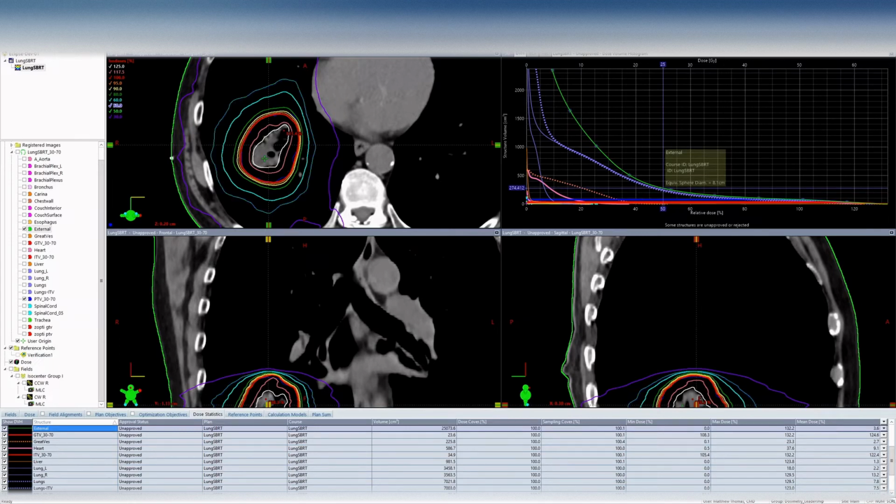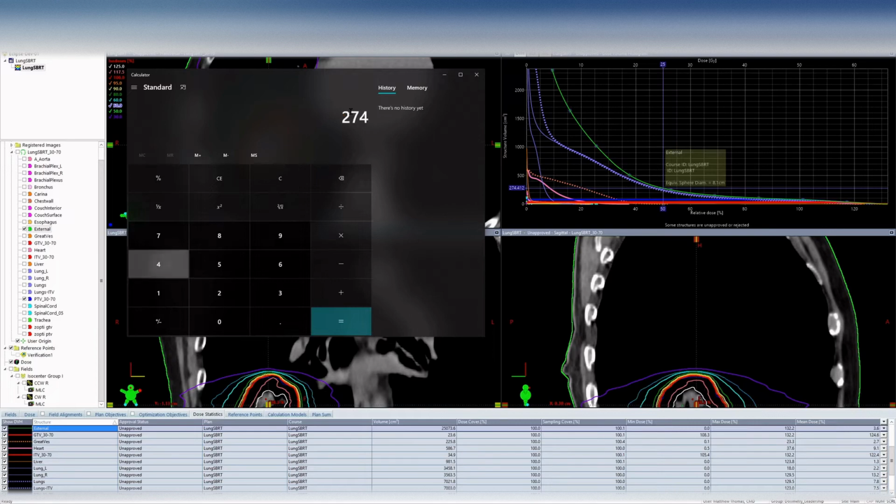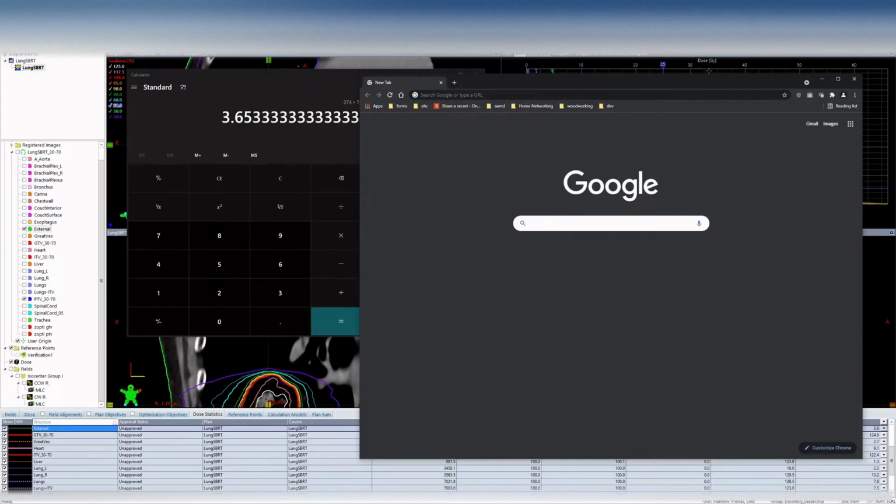So 274 divided by 75. Okay, so it's 3.65, give or take. And then what we have is a table from RTOG. There was a protocol that I believe a lot of people still use, but I can pull it up in just a second.